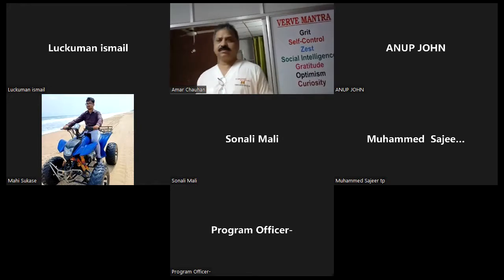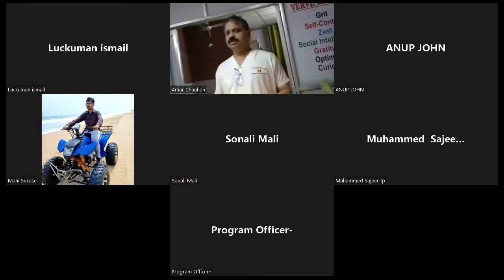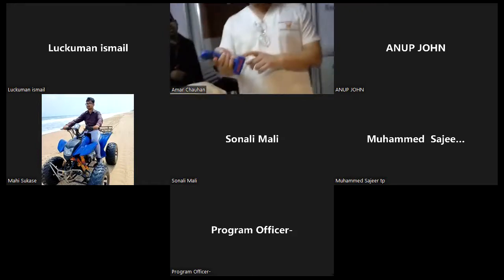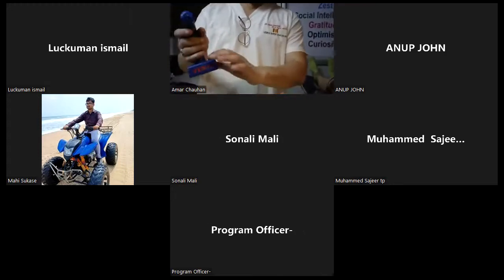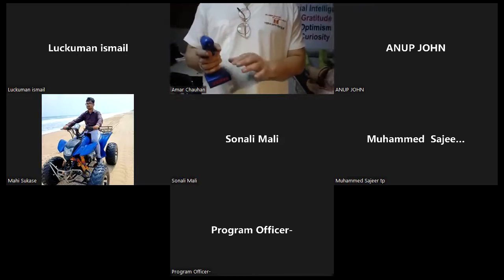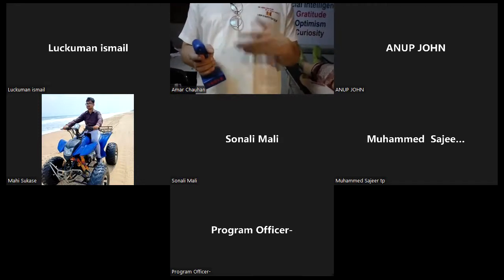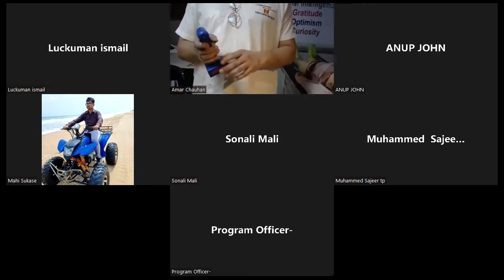So do you have the brochure, Mr. Lukman? You have to show that it should be for 300 plus charges in the brochure. This is the driver. So here is the battery. Usually the imported ones are use and throw. Once you use their power driver, you have to throw it. But we have given the option that we will change the battery at a very low cost.